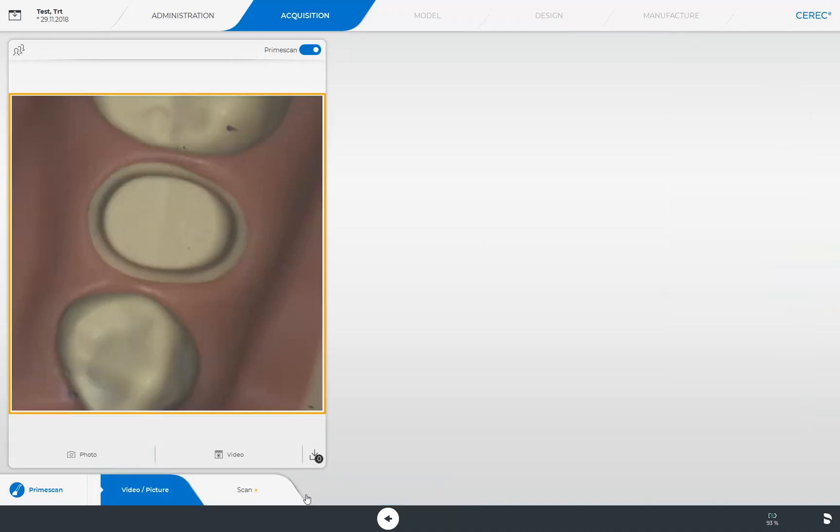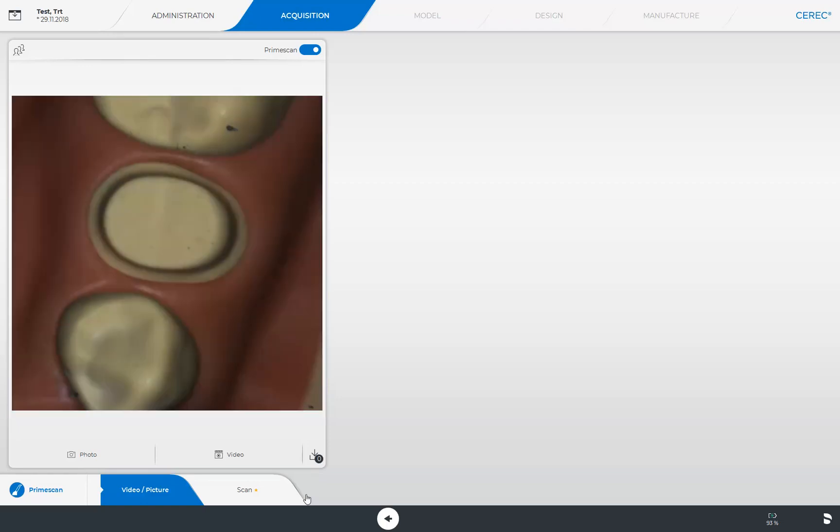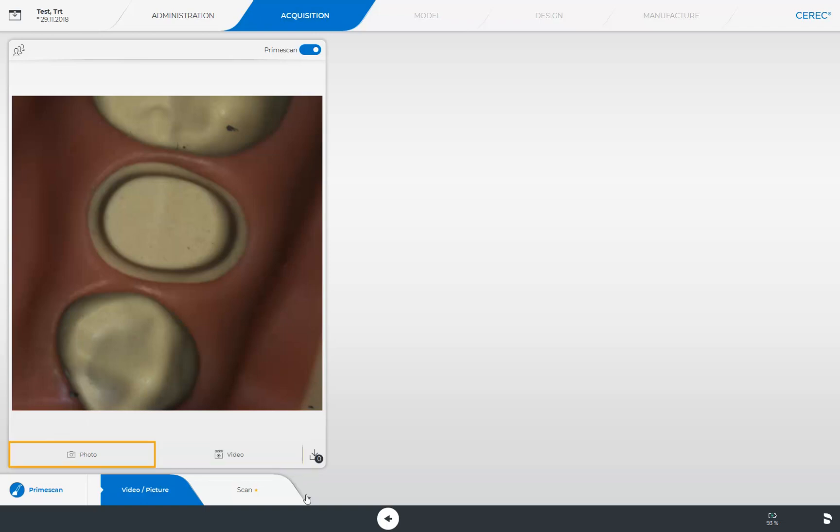The scanner view window displays the area that will be scanned by the prime scan. Below, we can choose between the photo or video options. To take a photo, we activate the photo button or use the foot control. This scan, for example, can be used for case documentation and can be downloaded for this purpose, or it can be used for illustration and communication purposes with the patient.